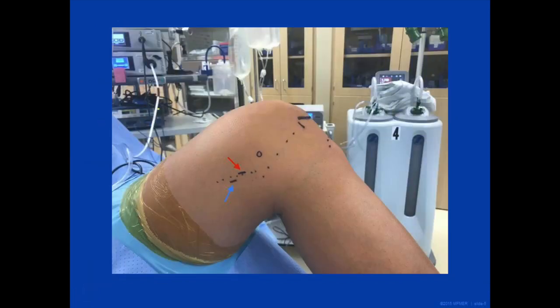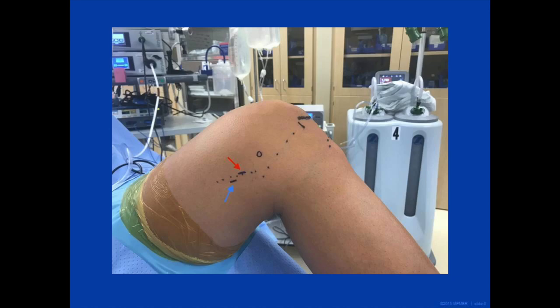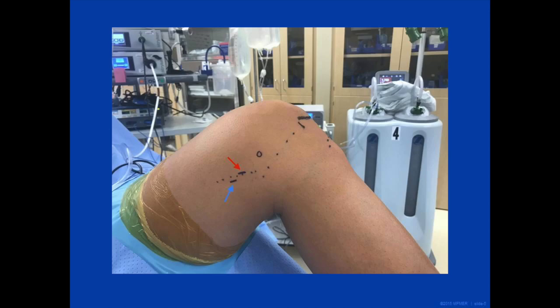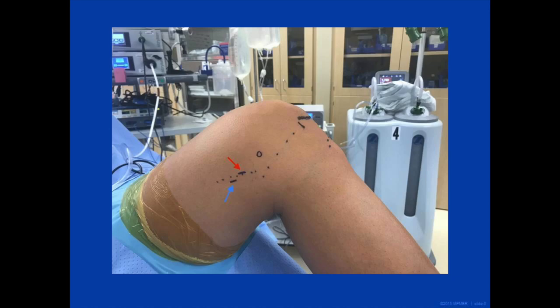We then establish two posterior medial portals by performing identification of superficial landmarks and then by direct visualization. Attention is turned to the superficial aspect of the medial knee where the incisions will be made. A soft spot located between the femoral condyle and the proximal tibia is palpated about 1 cm posterior to the edge of the joint line. The soft spot is formed by the medial head of the gastrocnemius, the MCL, and the semimembranosus.